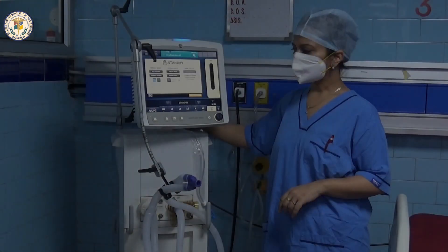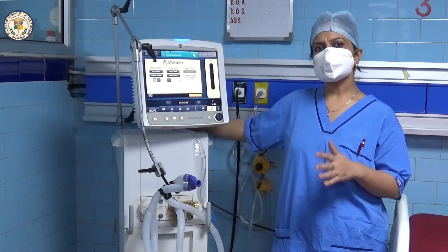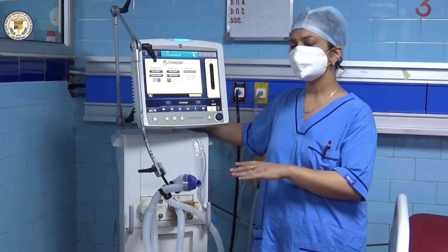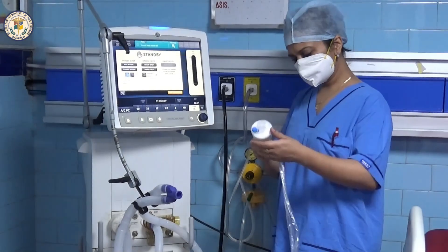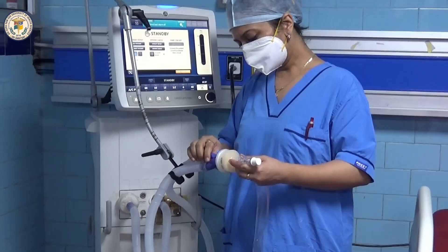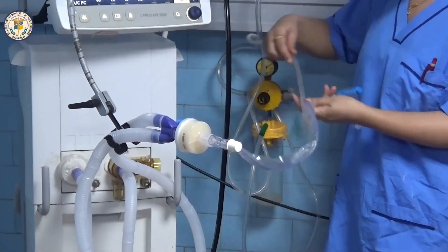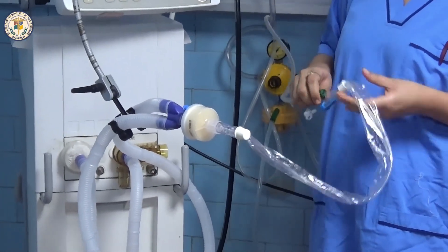The ventilator should be prepared and checked beforehand. The settings chosen must be set and the ventilator put on standby mode; settings can be varied later depending upon the patient's response and condition. Do not forget to attach the HME filter to the patient's end of the circuit as well as the expiratory limb. Prepare the closed suction system before intubation so that the patient is immediately connected to the ventilator after intubation and unnecessary disconnection is avoided.